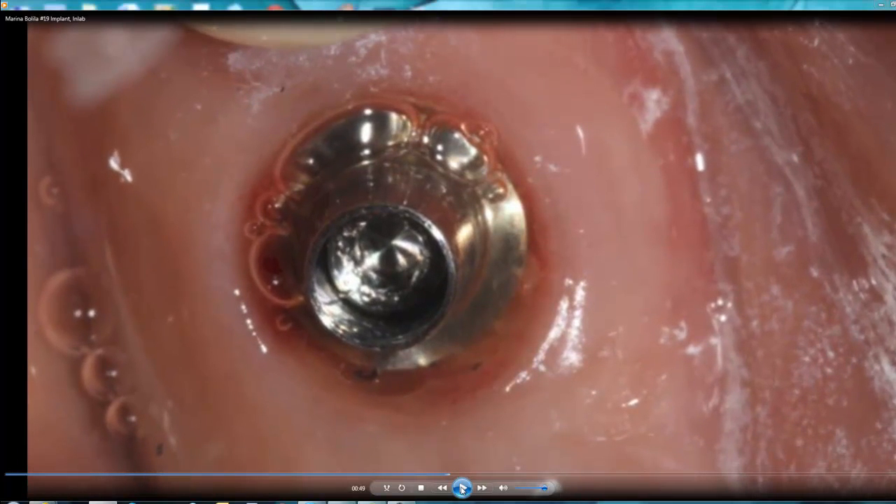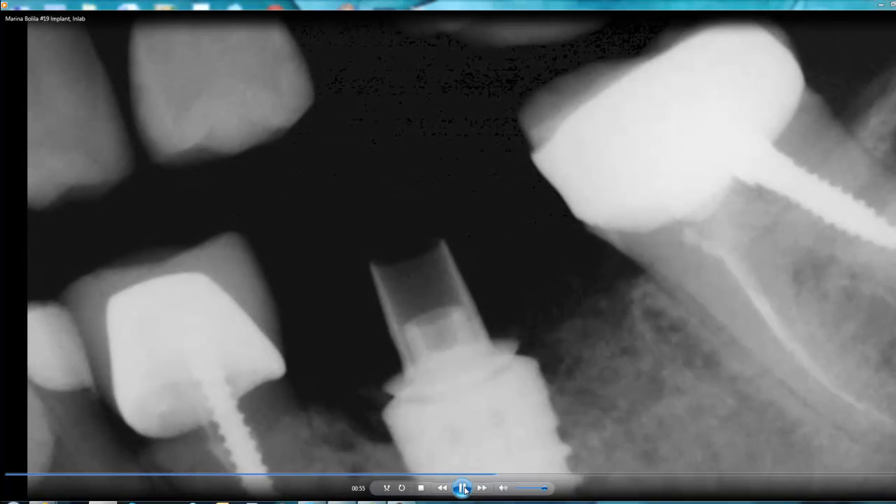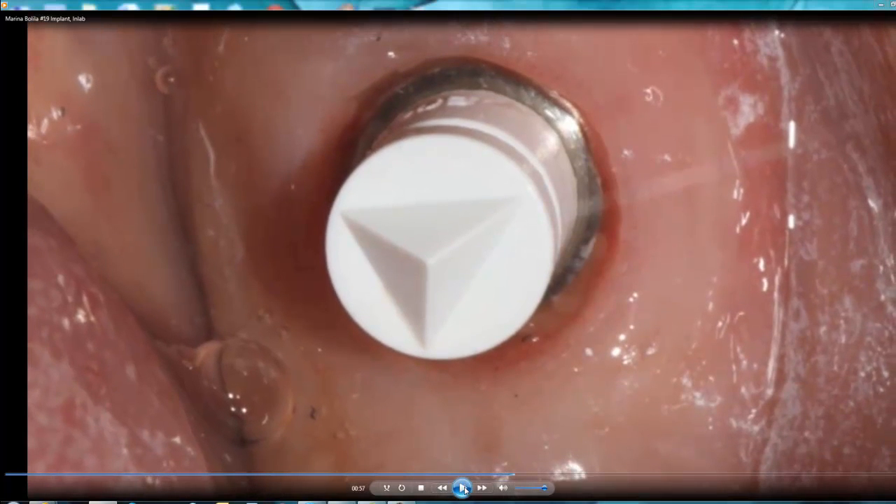I put the tie base on the implant and take an x-ray to verify its position. You can see again it's a platform switch and the tie base sits perfectly — right in the middle — to make sure the restored implant looks nice. We then place the scan body on top, and by placing the right anatomical healing cap you get a view of where the scan body will locate. Make sure it's all the way down and you can see the outline of the implant.